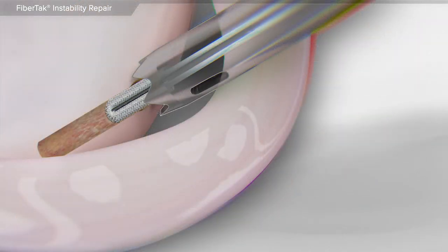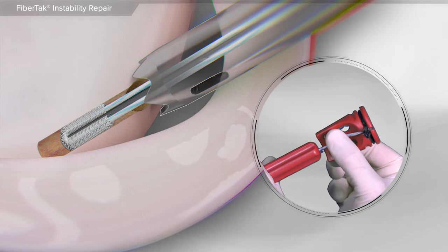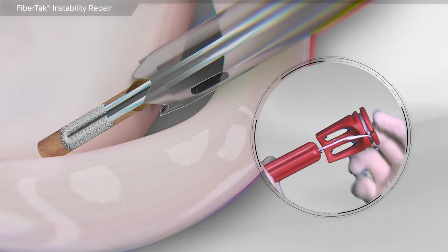Leaving the guide in place, the fiber tack all suture anchor is inserted into the bone. The anchor is then set by pulling back on the handle. Final fixation is accomplished by removing the handle and firmly pulling on the remaining sutures.